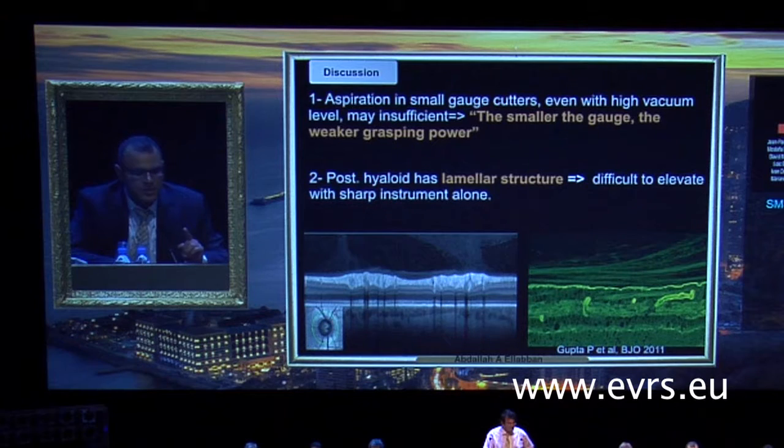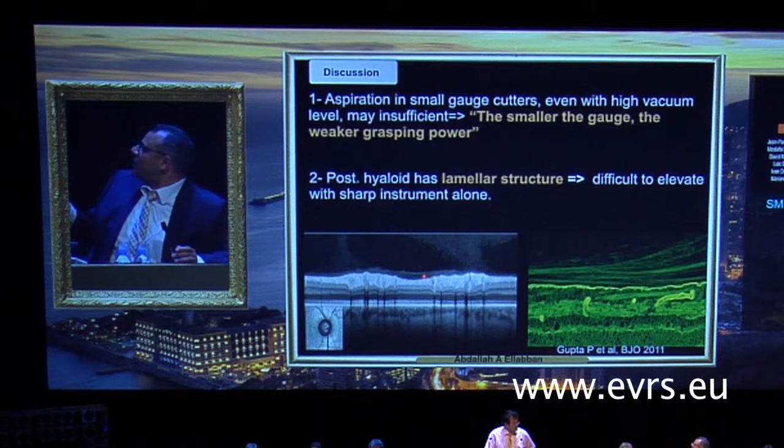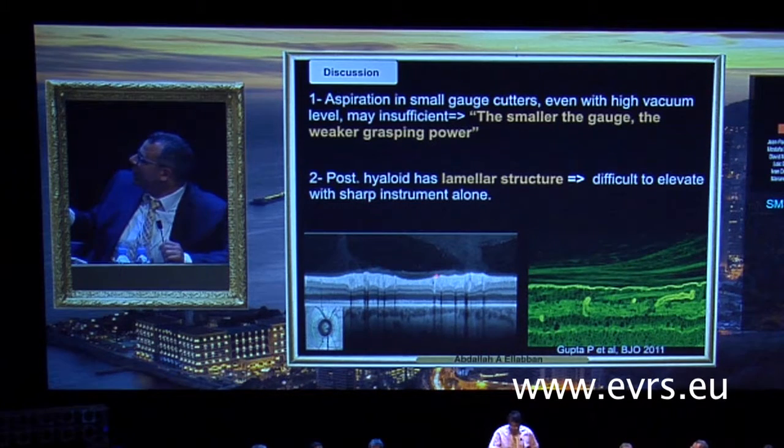If you do a peripapillary scan and you slightly change the contrast, or you have a machine with enhanced vitreous visualization mode, you can appreciate the attachment of the posterior hyaloid near the disc. And if you look at this example, you can see how dense the attachment of the posterior hyaloid is, and how dense such lamellar structure is around the disc in this region.